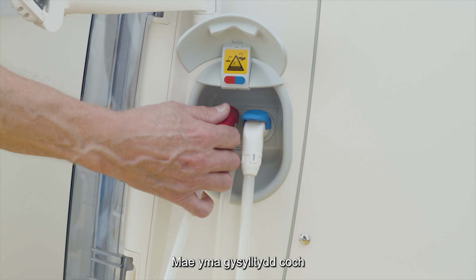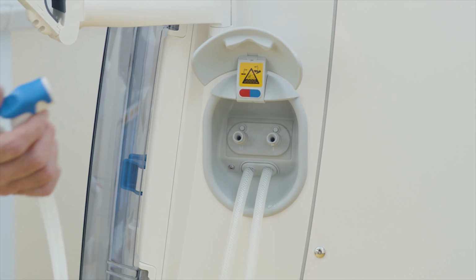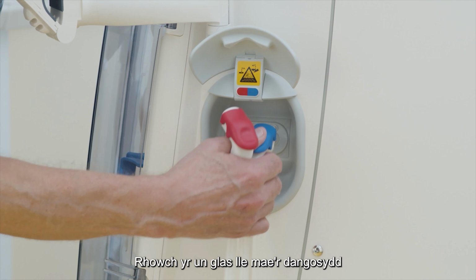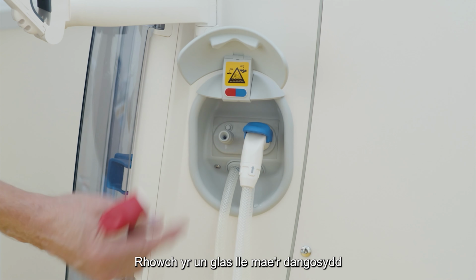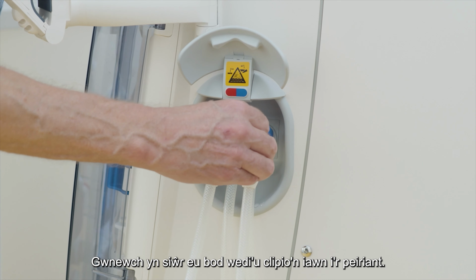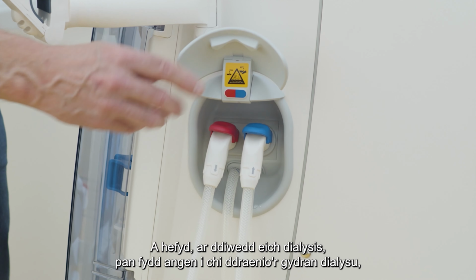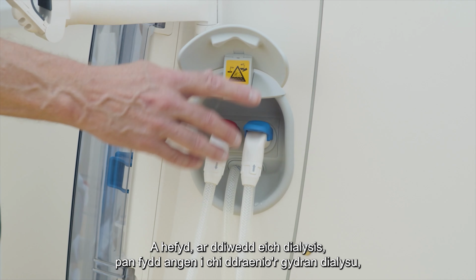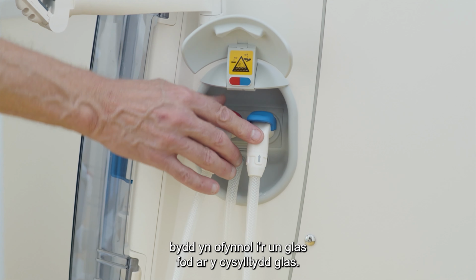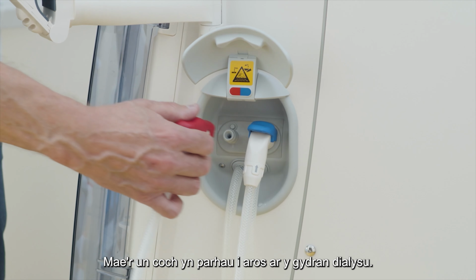You have a red connector and a blue connector. Be aware that you have to follow the color code here. Put the blue one where the blue indicator is and the red one where the red one is. Make sure they're clipped on properly. The machine will not disinfect correctly if they're not clipped on. And also at the end of your dialysis, when you want to drain the dialyzer, the blue one needs to be on the blue connector. The red one still stays on the dialyzer.